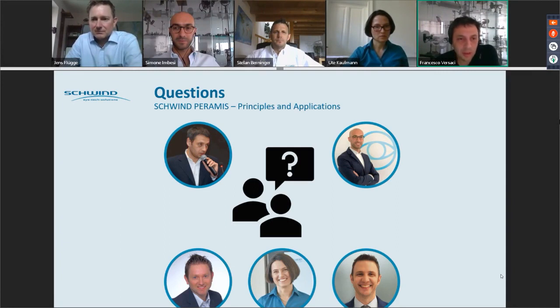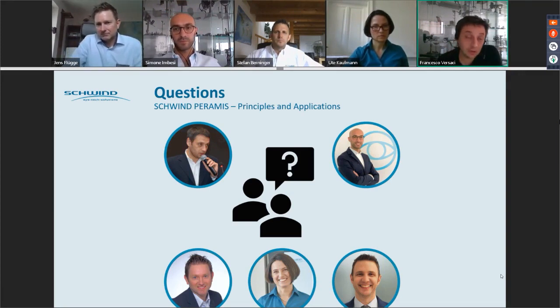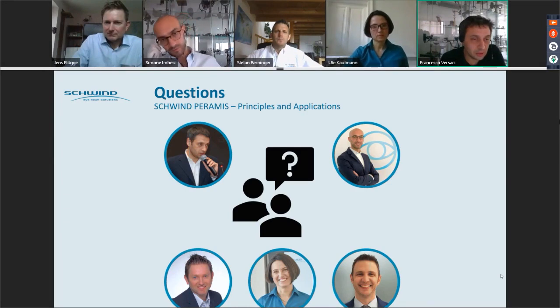I fully agree with Simone's answer about the angle kappa, because the angle kappa is nothing but the big decentering of the pupil center with respect to the corneal vertex, but this doesn't impact that much on the quality of the acquisition. It can impact the quality of the export, because if the pupil is strongly decentered, you may have more issues reaching the minimal diameter for the export, but it doesn't impact the quality of the keratoscopy itself.